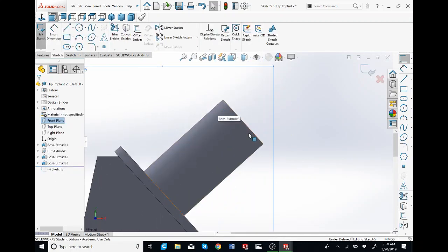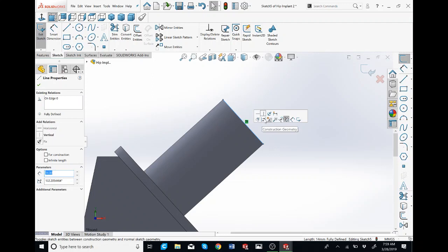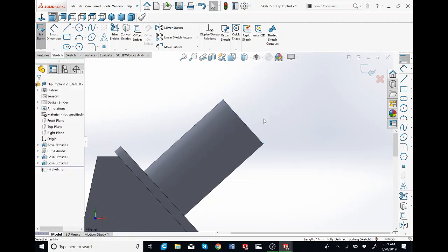I'm going to zoom in. I'm going to hover my mouse over this line, and then I'm going to click convert entities. This will convert that line that I have. So convert, you see that there's a point here and a point here showing that this line has been made by the conversion entities. I'm going to click on this line because I want to make a construction. So I click on this and construction geometry, which is the same as a center line.